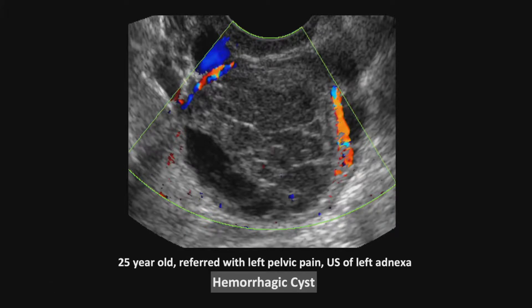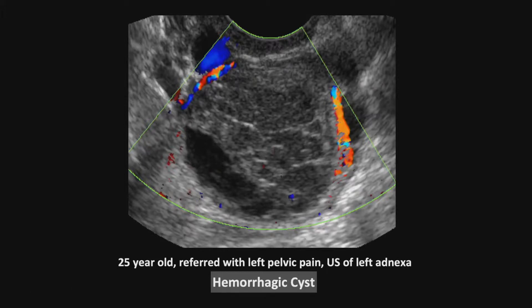What is really critical is that your velocity scale is between 5 and 10 centimeters per second, your gain is set high, and your filters are set low, so you can pick up any blood flow that exists inside.